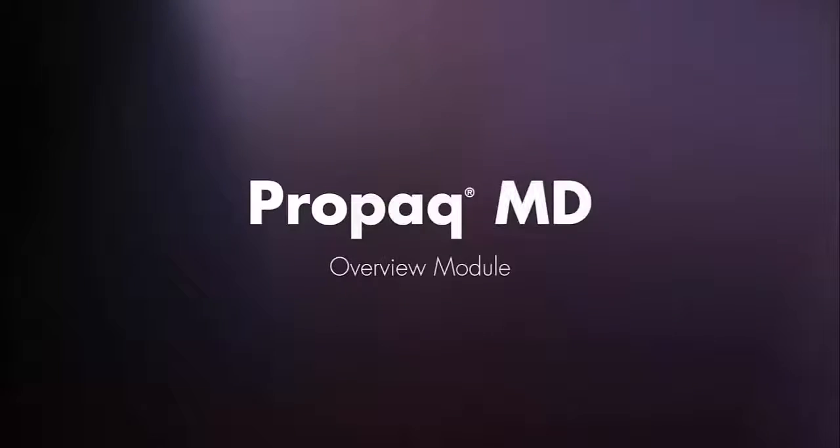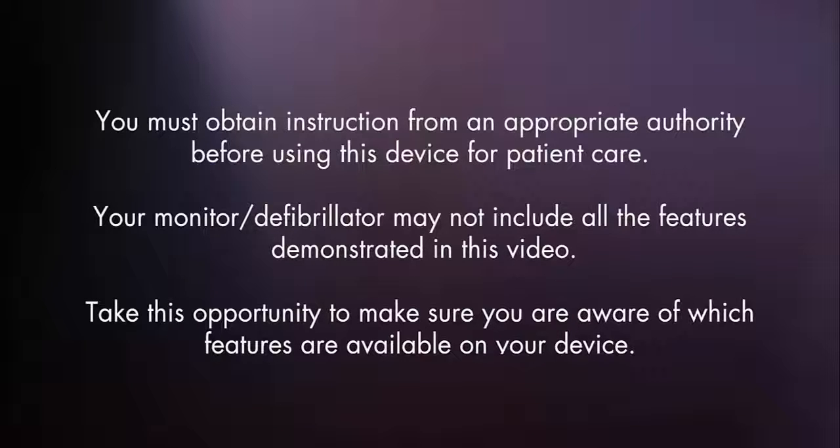Welcome to the Propaq MD Overview module. These training modules are an adjunct to formal training. You must obtain instruction from an appropriate authority before using this device for patient care.